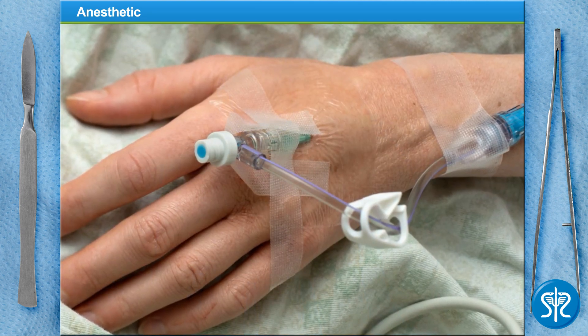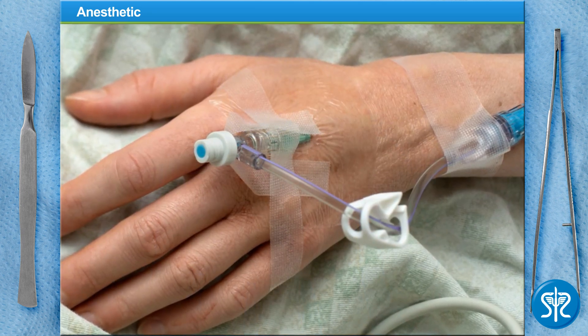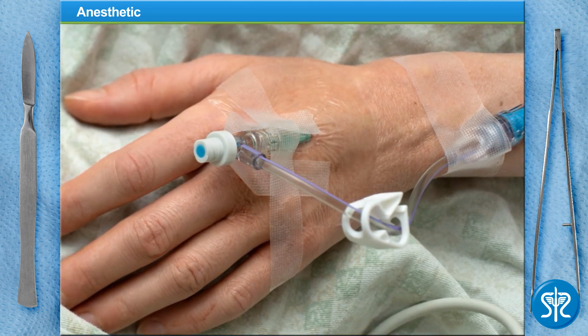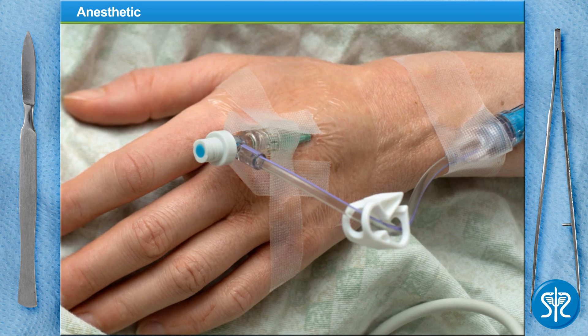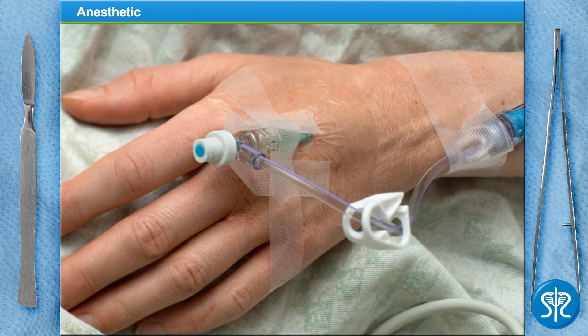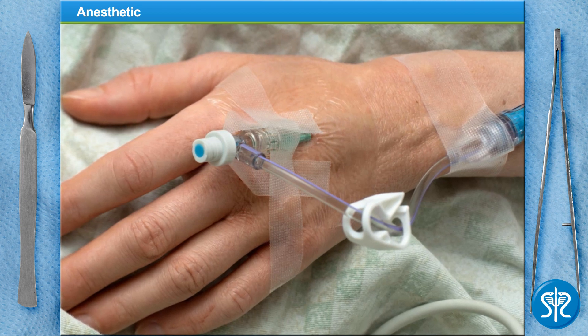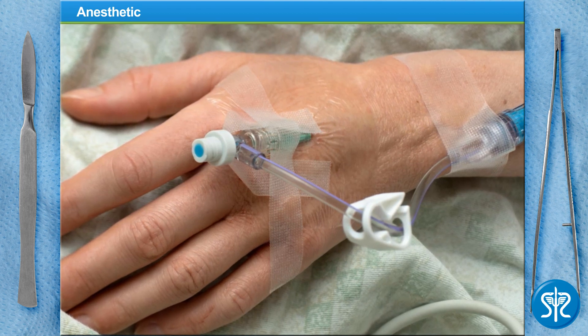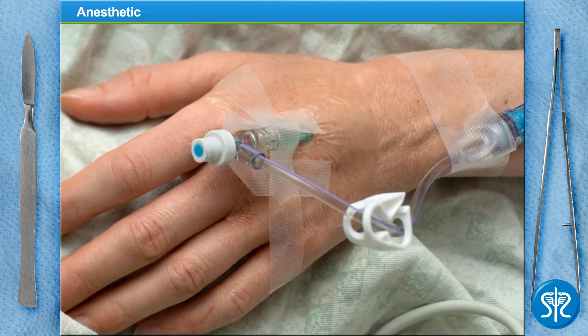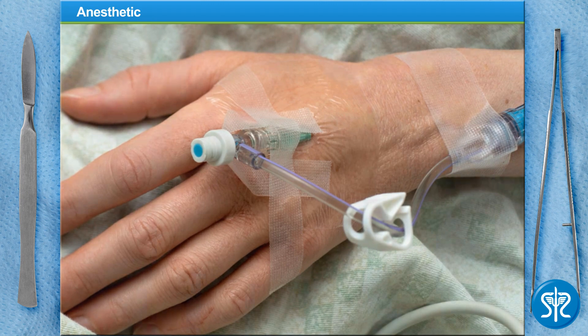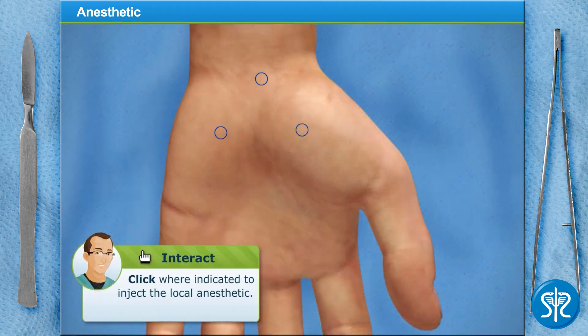A sedative is a drug given through an IV that places the patient in a dreamlike state. However, our patient today will only receive the local anesthetic. Go ahead and get the operating area numb.